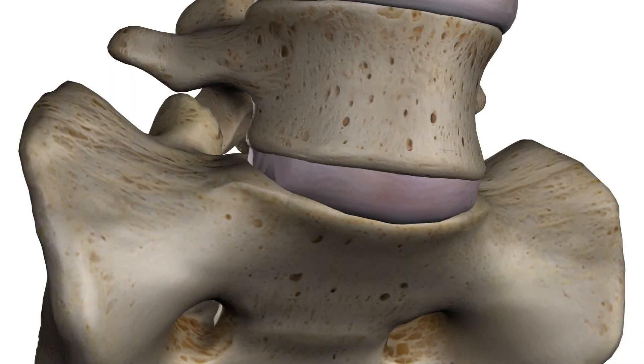Zoo A-Lift Plate. Let's take a look at the CoreLink Zoo Anterior Lumbar Plate System.